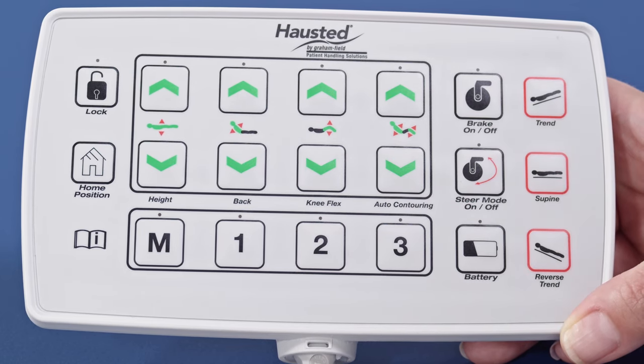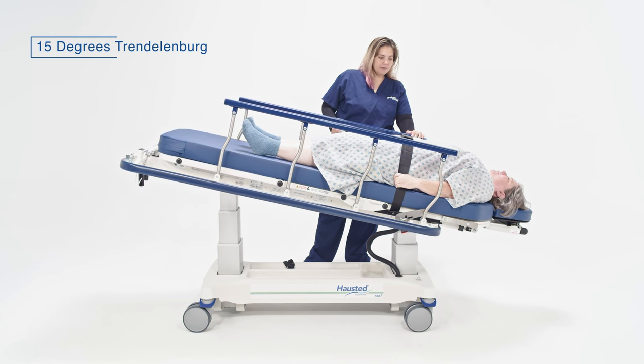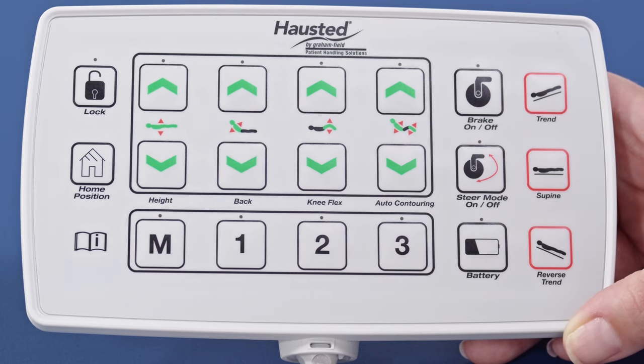For enhanced patient comfort and safety, all the 5E82 stretchers have 15 degrees Trendelenburg and 15 degrees reverse Trendelenburg, all controlled by the intuitive hand pendant.